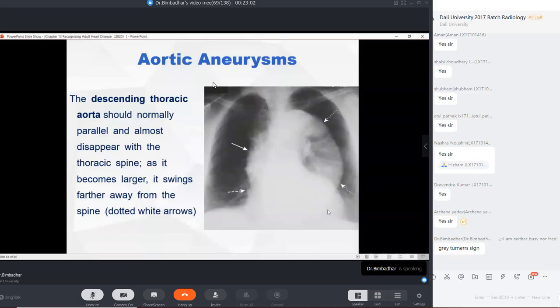Okay, right? So this is how a big thoracic aneurysm will look. Do not worry if you do not understand the complete logic, it is fine. This is a professional diagnosis, but still remember this X-ray image. We can have an image like this and ask you, okay, what is this appearance? Thoracic aortic aneurysm. That's it, simple. Just for examination purposes, remember these images.